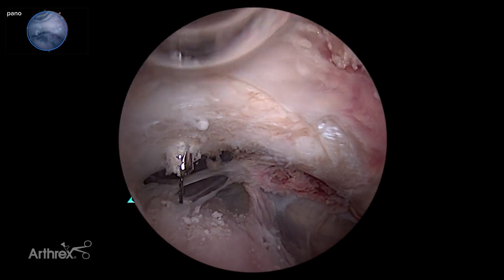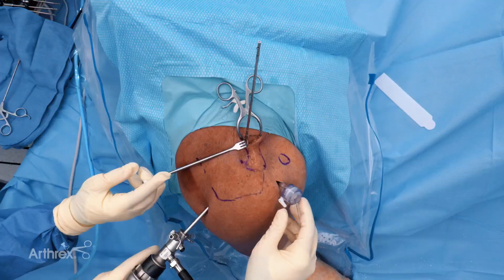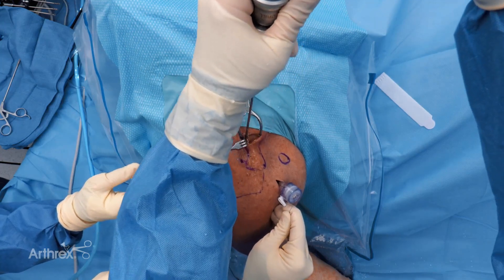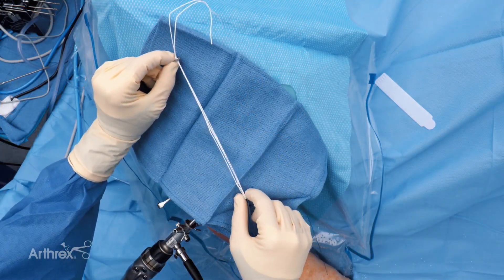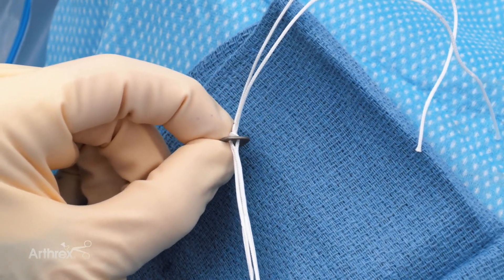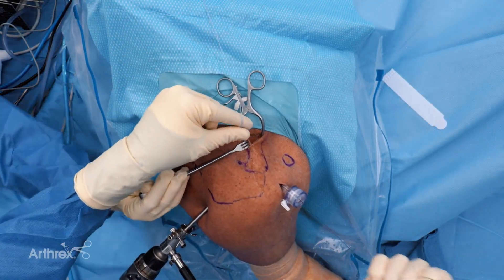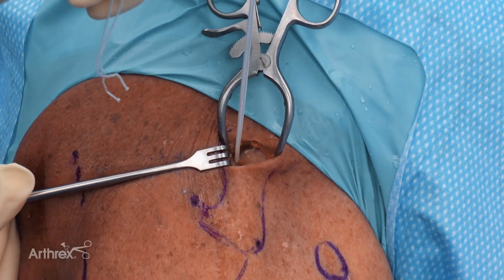Once we see the wire in the subcoracoid space, we bring it through the grasper and out of our cannula. With the wire through, we can remove the drill bit — by hand or by power — holding the wire so it doesn't go anywhere and just backing it out. This is our implant: you can see we've got a clavicular button up top, pre-assembled with a number six suture in a tightrope configuration, and a passing loop distally that will pull antegrade through our three-millimeter drill hole. We'll use our loop suture through the wire to pull it down, and that blue suture is used to guide and pull through our tightrope.